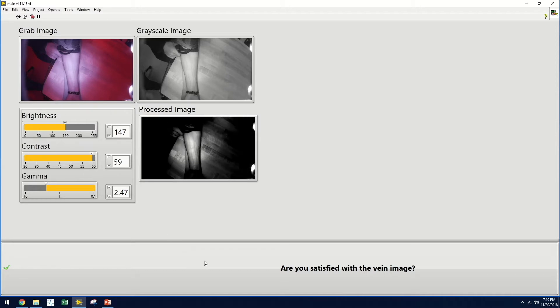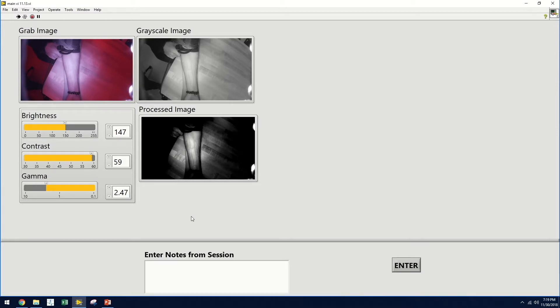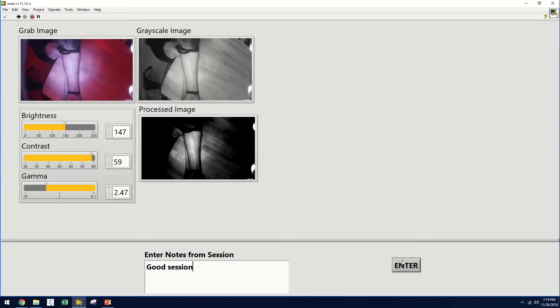Once they are satisfied, they can click the button at the bottom half of the screen and it will save the image to the patient profile. They can additionally enter any notes that they have from the session, which will also save to the patient profile. Once they hit enter, the program will end.